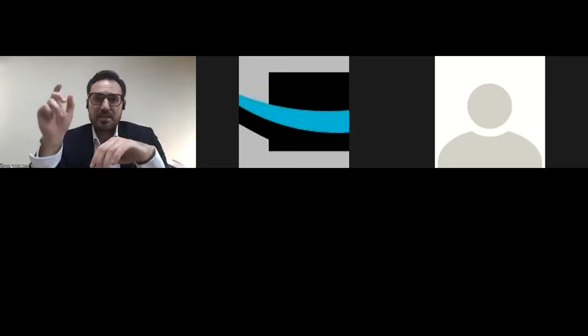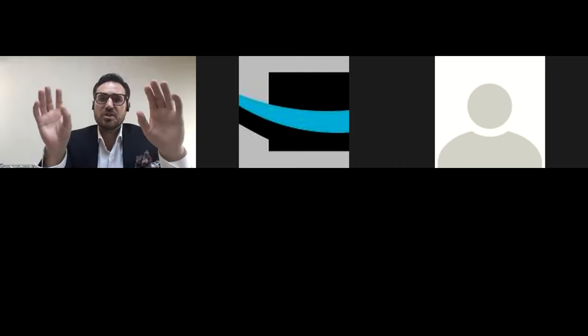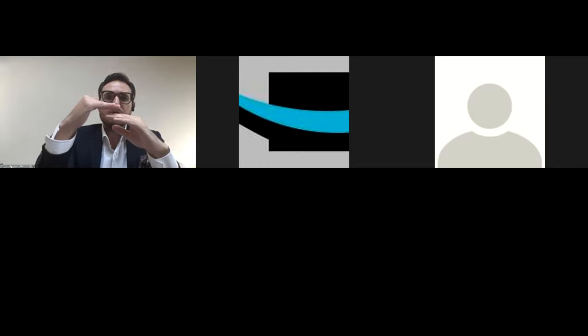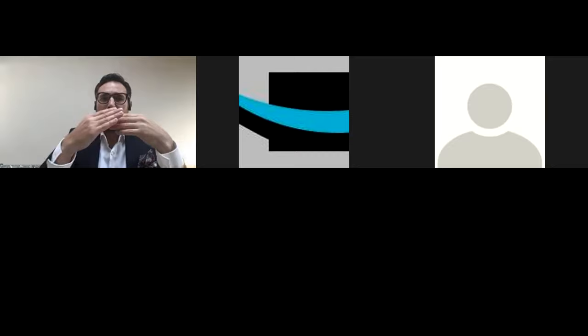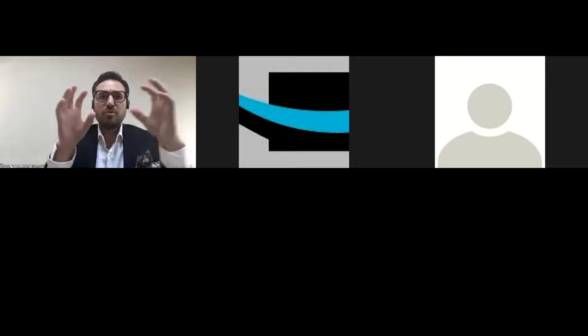The only trick that I can give you is to put the scan abutments in different positions. For example, for the geometry alignment tool, that is the inclined plane of the scan abutment, one scan abutment, for example, on the vestibular side, and the other one on the palatal side, in order to facilitate the scan in recognizing exactly each scan abutment.